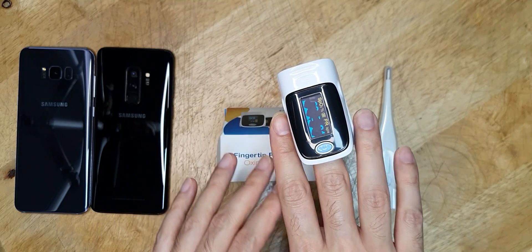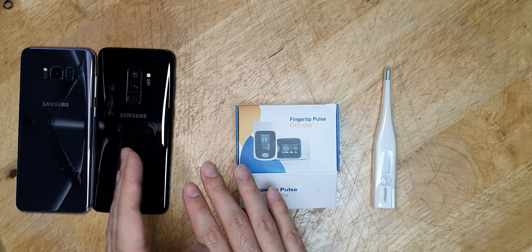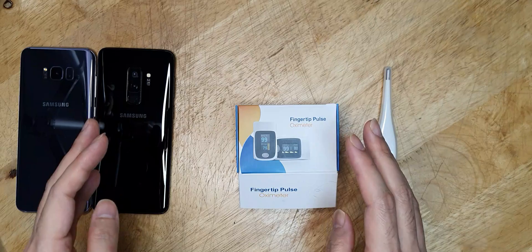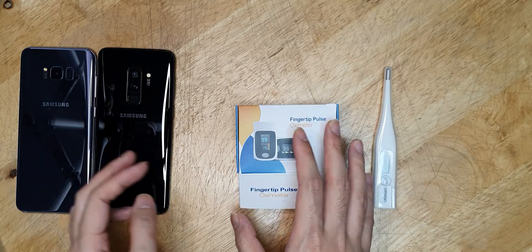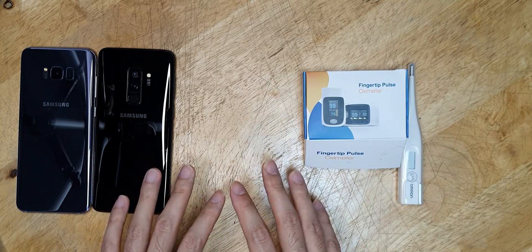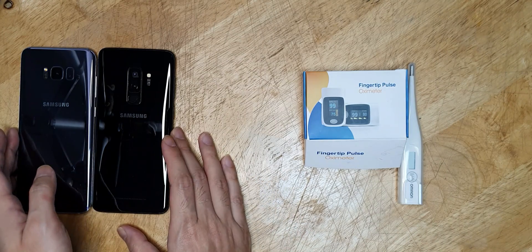This is a very simple device. I want to discuss other ways of measuring SpO2, like through mobile devices or apps, and I want to discuss whether these devices are actually accurate or not. There are many claims from companies like Samsung, which claim to measure the SpO2 level in your blood using mobile devices and the sensors built into their devices. I have two devices here.